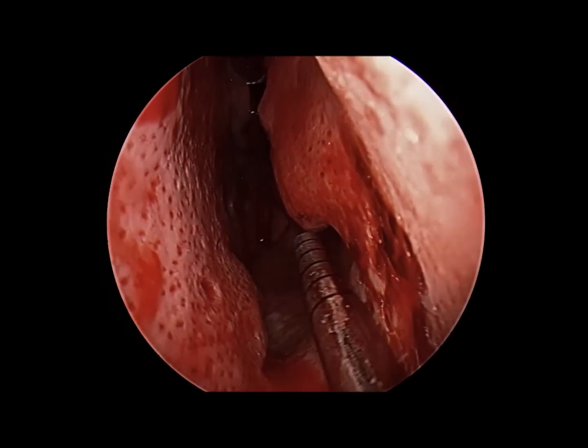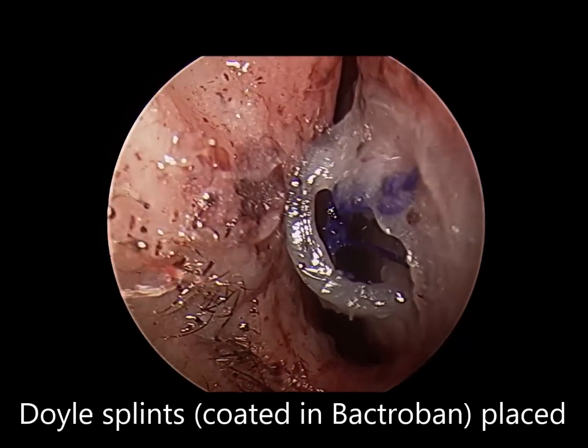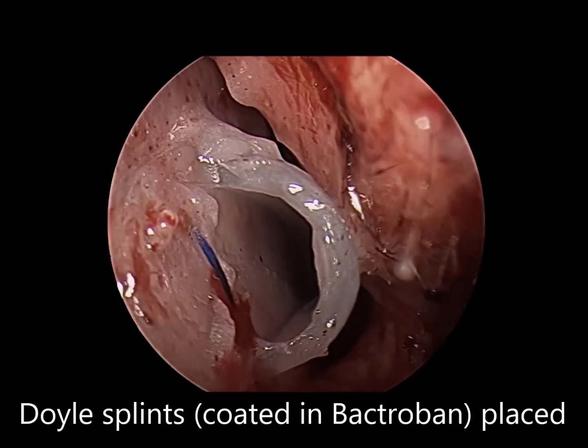The hemitransfixion incision is closed with several interrupted chromic resorbable sutures, and then Doyle splints will be placed on each side to ensure the patient's septum will heal quite nicely.